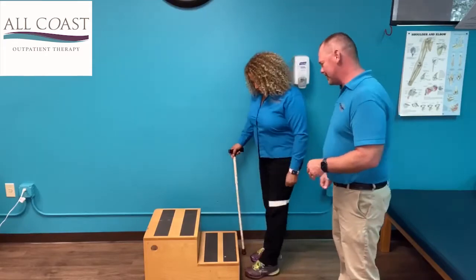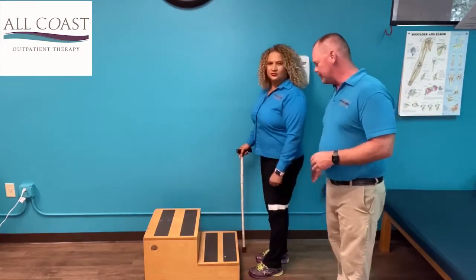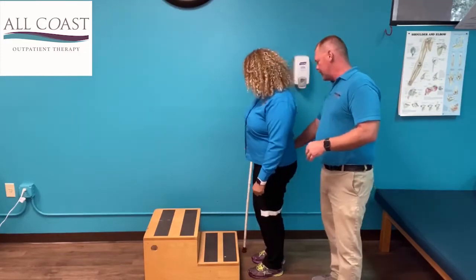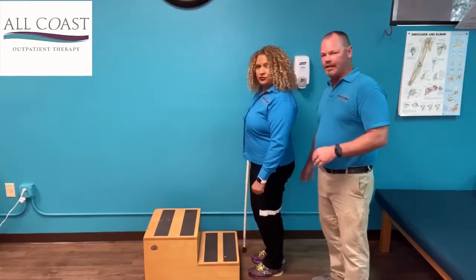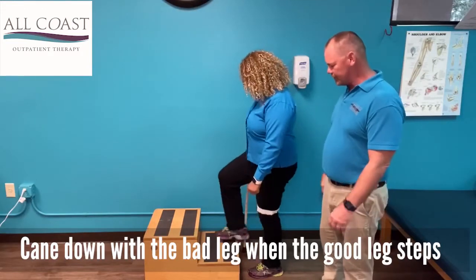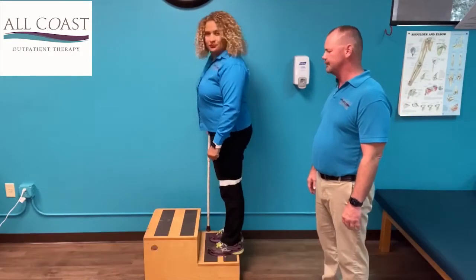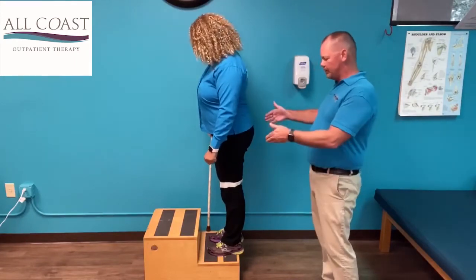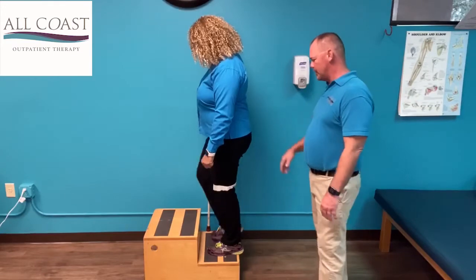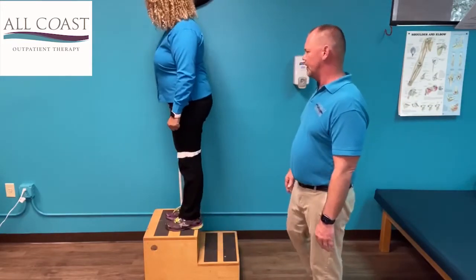When you're going up the step without a rail, you want to lead with your good leg. At the same time, you're going to bring the cane down with the bad leg. So go up with the good and then follow it up — you can bring both the cane and the bad leg up at the same time. Go on up — there you go.